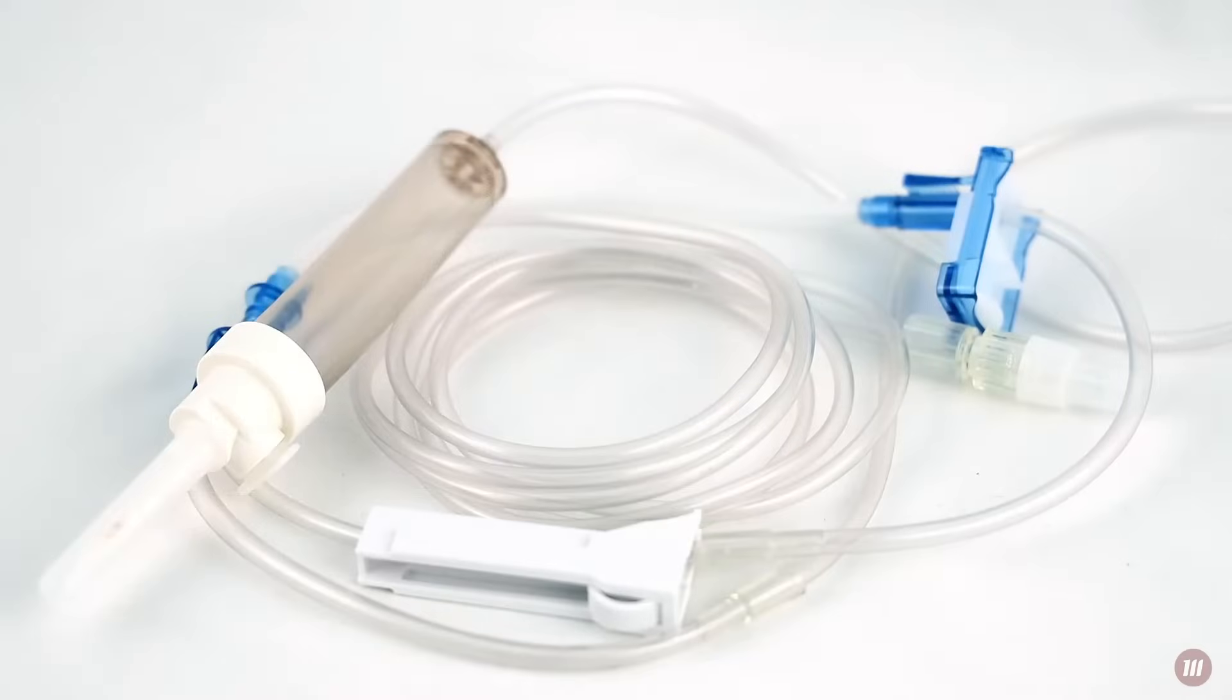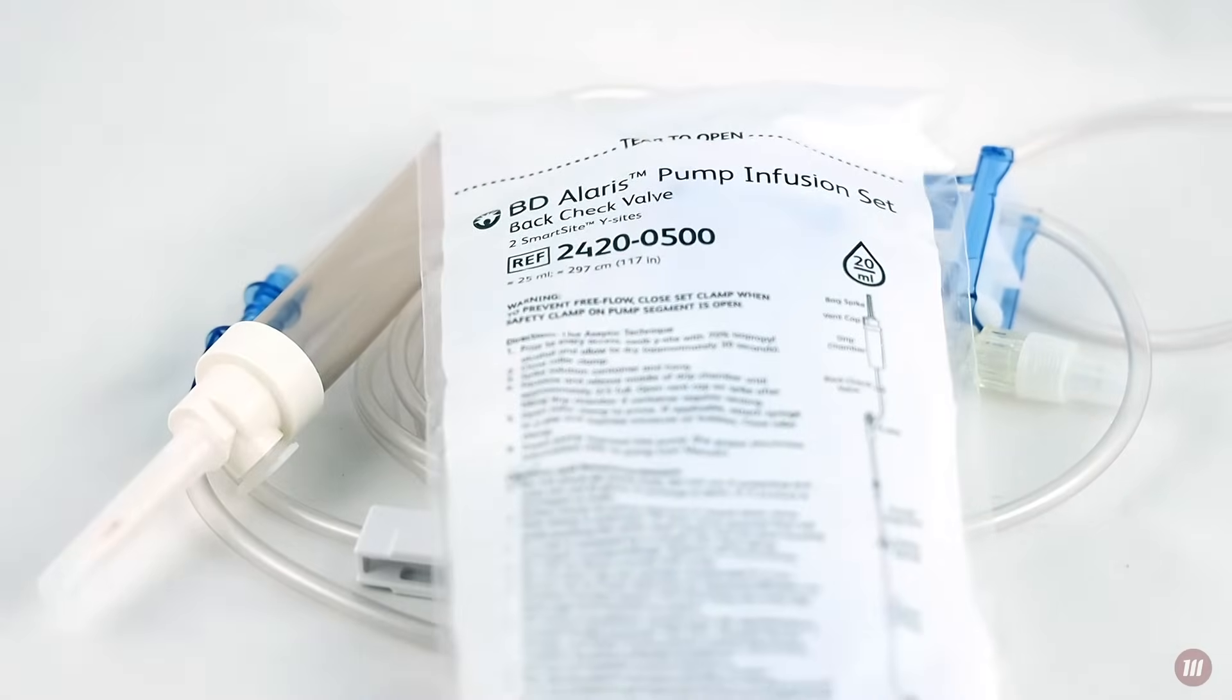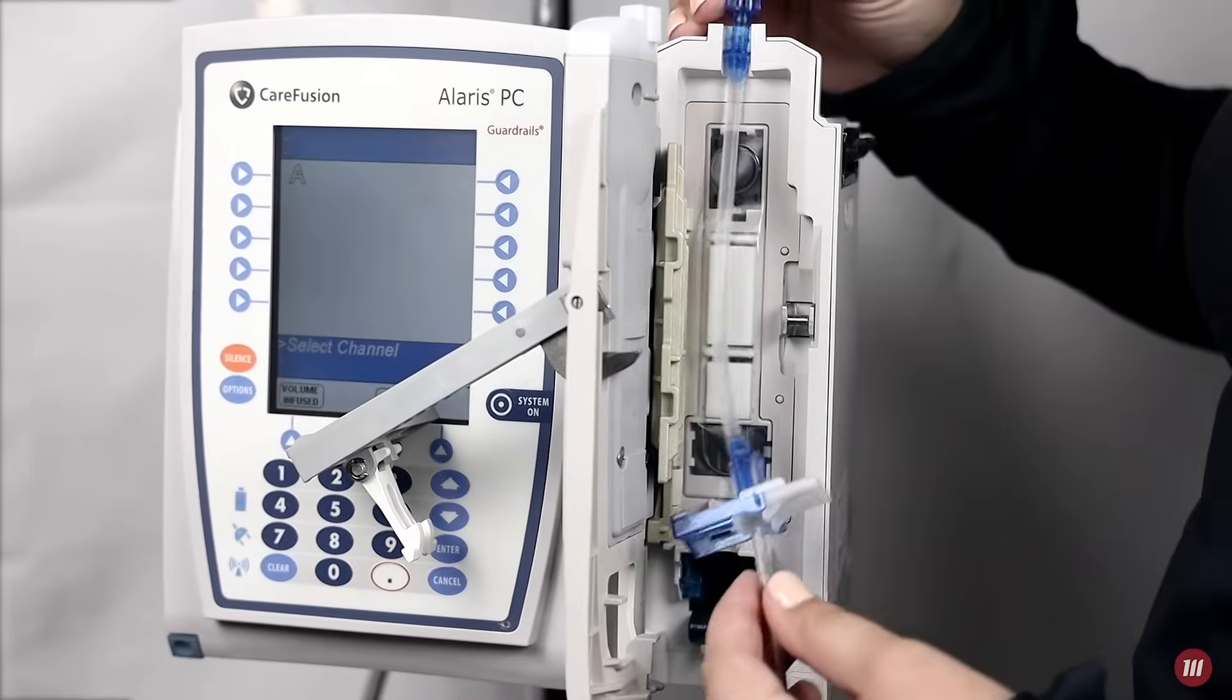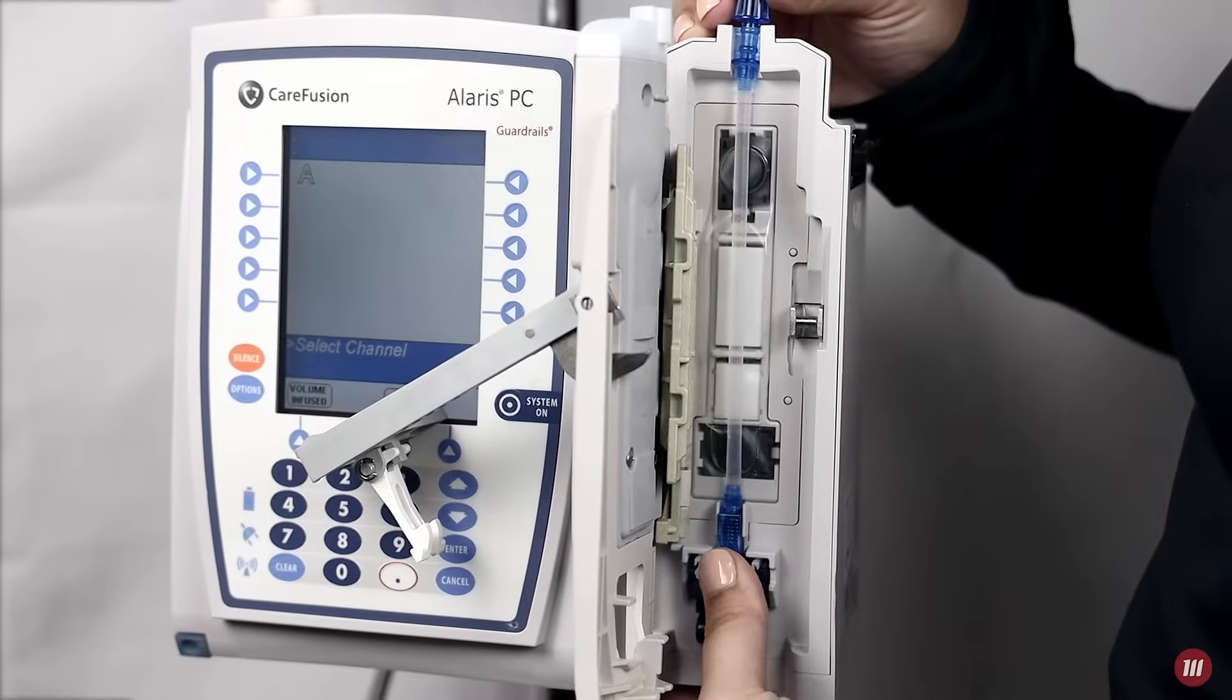The Alaris 8100 is compatible with a variety of BD Alaris dedicated tubing sets. Flow rates range between 0.1 and 999 milliliters per hour.